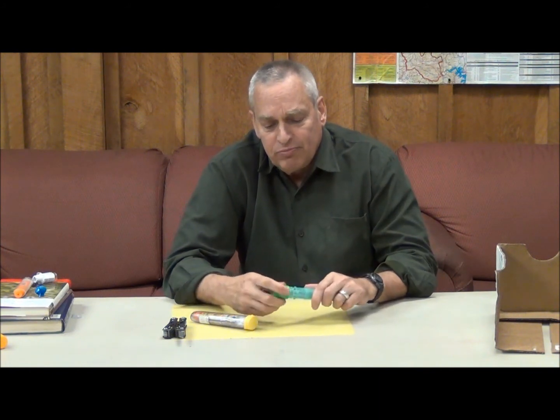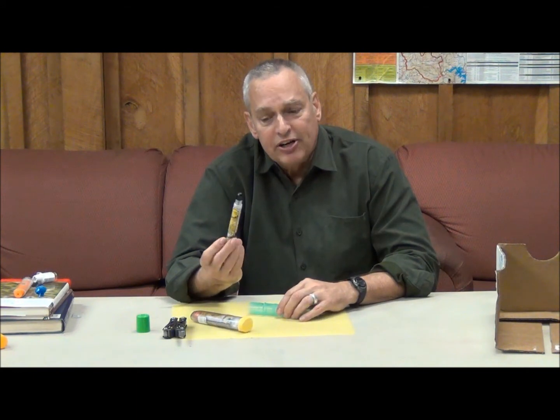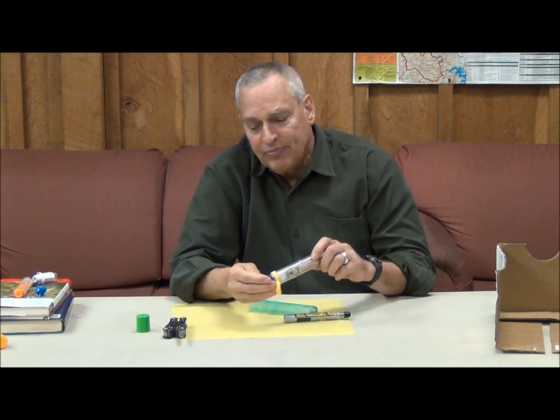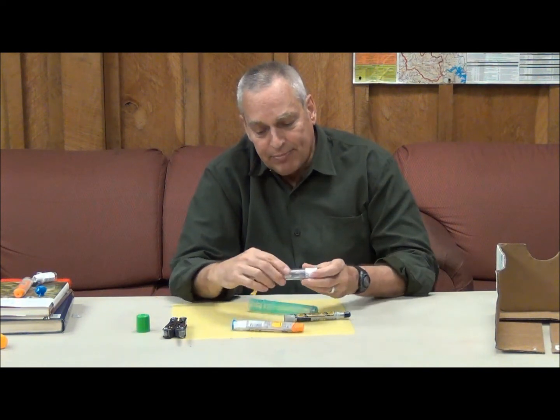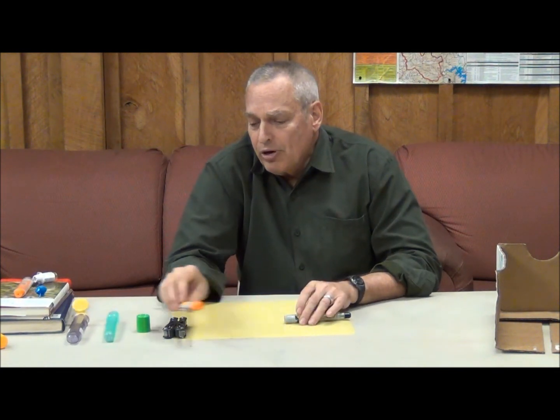Those of us interested in wilderness medicine are quite interested in the EpiPen because anaphylaxis is such a concern in the backcountry. There are actually now two styles of EpiPens. The original EpiPen came in a round container. The new EpiPen comes in an oval container, and they're really not quite the same. They both work with a similar mechanism, and to start out, we'll go ahead and discharge the pen like we're going to use it on an anaphylaxis patient.